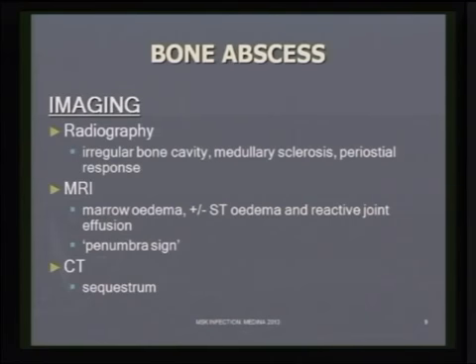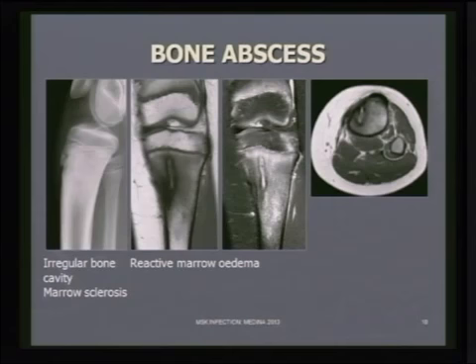An important sign, which we'll discuss in a little bit of detail, which is almost diagnostic of a bone abscess, is the penumbra sign. In addition to radiography and MR, CT may be helpful by demonstrating a sequestrum. So these are the classical features.